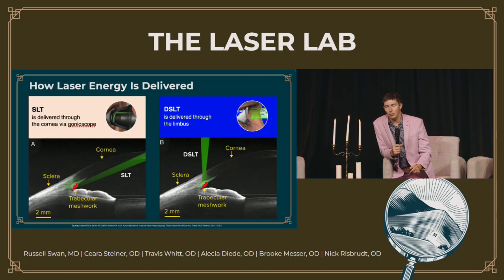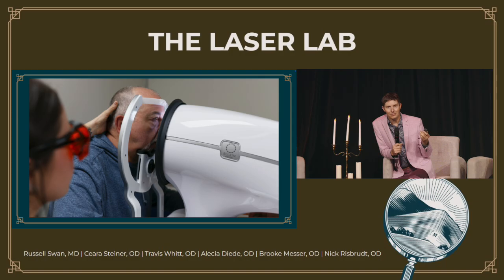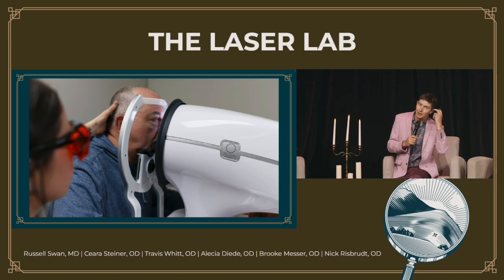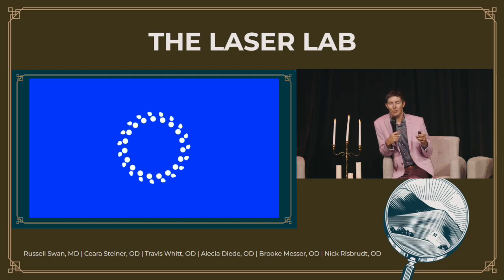Next thing I just wanted to hit on was direct SLT. So traditionally, we've always done indirect SLT. We now have the ability to do direct SLT. Direct SLT, for what it's worth, again, we're delivering the energy. And I'm going to play this video. This is actually one of our previous fellows, Brian Schaefer. And it just shows you, not that I dislike SLT, but man, direct SLT is quite nice for patients to go through. So we'll play this.